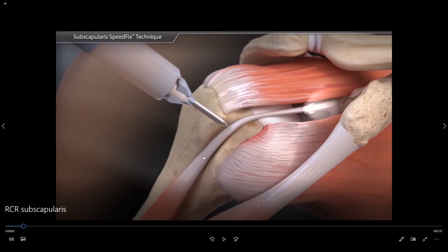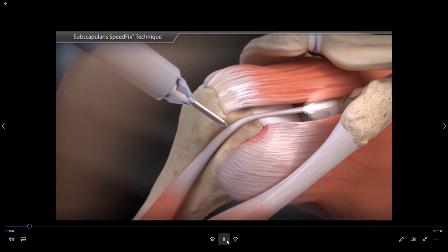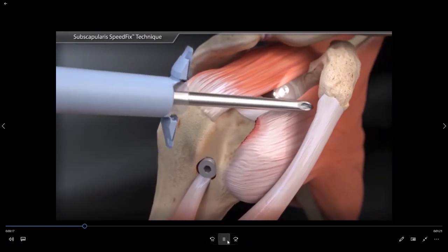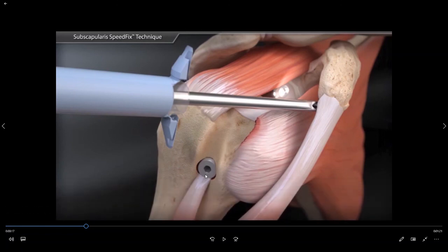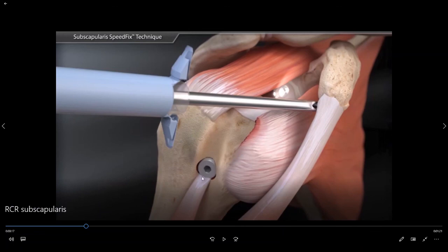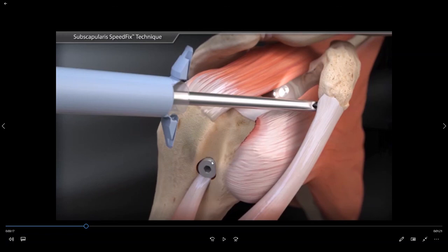If this tendon is maltracking, or if it is significantly torn or has disease that could cause pain or symptoms, we also want to address the biceps at the time of a subscapularis repair. So in this particular video we have cut the biceps tendon, drilled a hole down here in the biceps groove, and reattached the tendon down here. This is called a biceps tenodesis procedure. When you reattach the tendon further down on the humeral head it no longer can flip back and forth and is much more stable. Also, if there was diseased tendon extending up into the joint we have now eliminated that potential source of pain or symptoms.